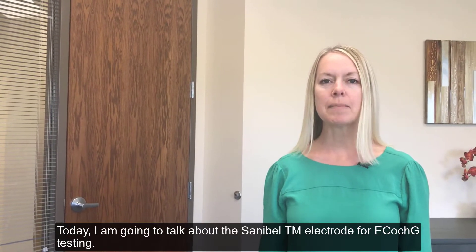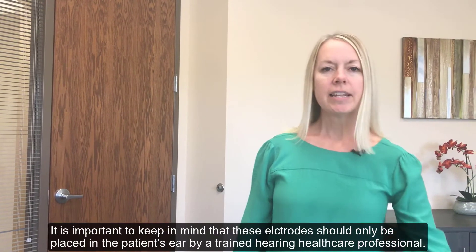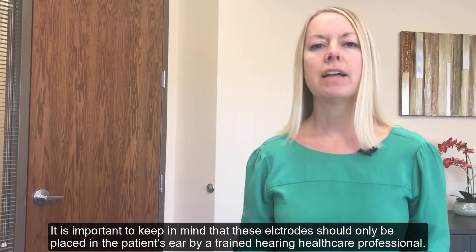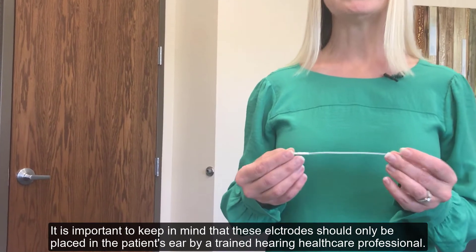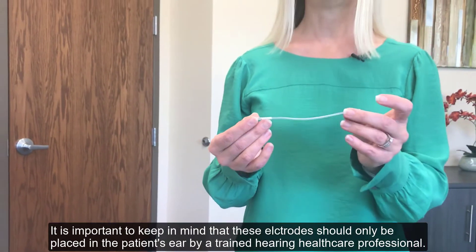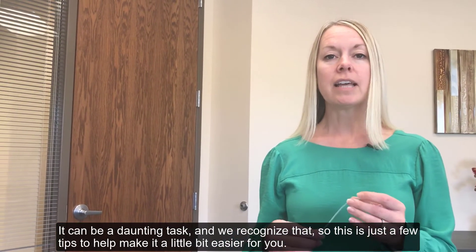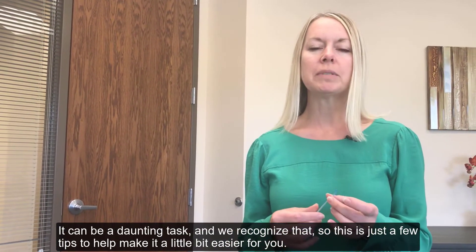Today I'm going to talk about the Sanibel TM electrodes for ECochG testing. It is important to keep in mind that these electrodes should only be placed in the patient's ear by a trained hearing healthcare professional. It can be a daunting task, and we recognize that, so this is just a few tips to help make it a little bit easier for you.